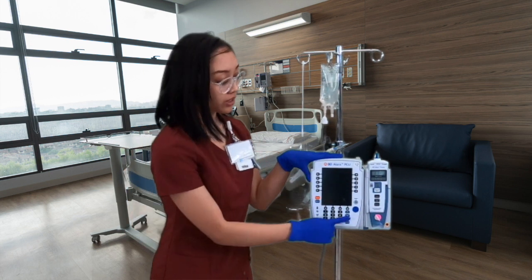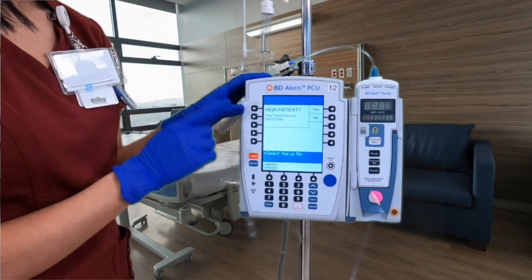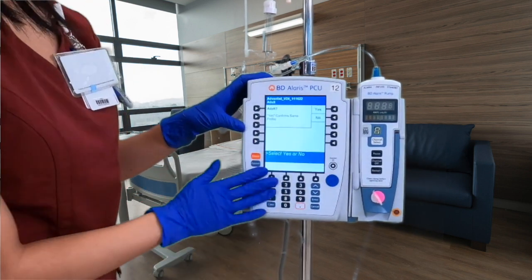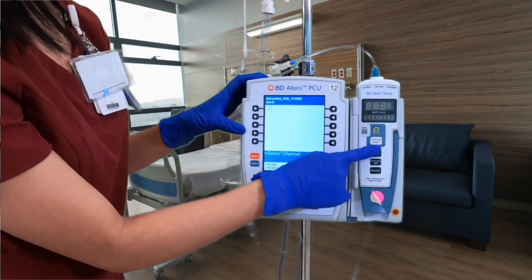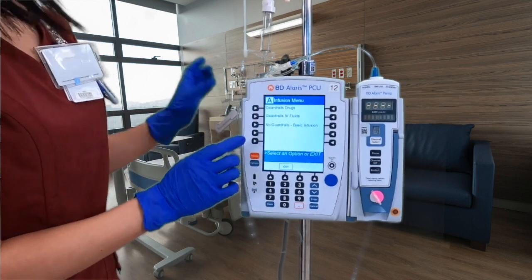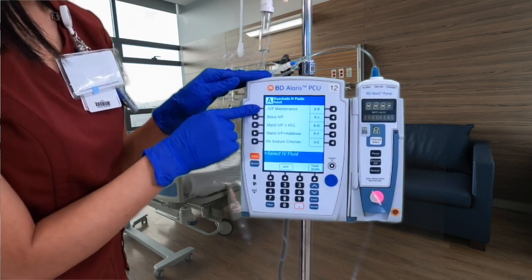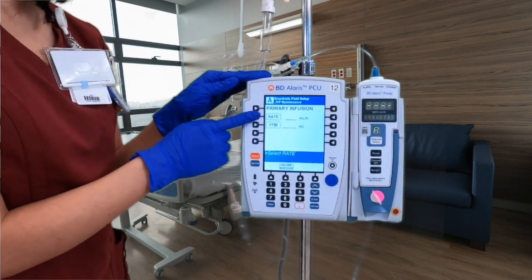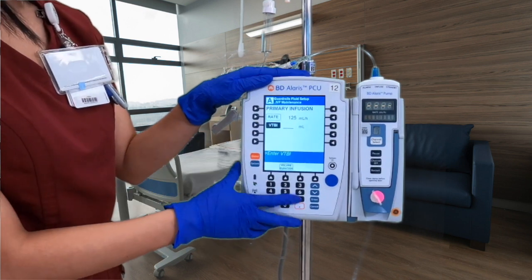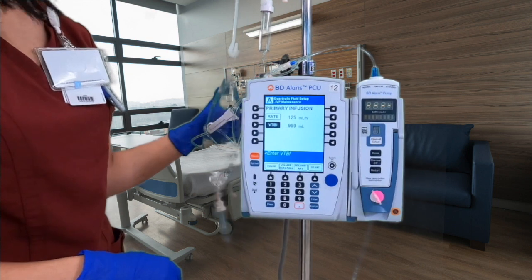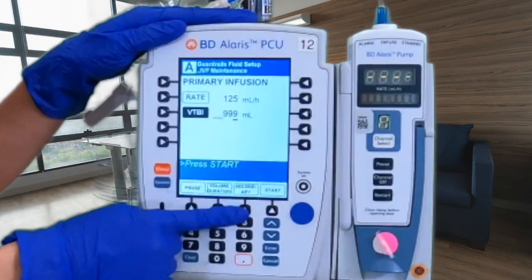Now we're ready to program. Press the system on button once. Because this is a new patient, press yes to clear previous patient data; because this is an adult, press yes again. Click channel select, then press Guardrails IV Fluids. Select IV maintenance fluid — yes. We now have our rate set to 125 mL/hr with a volume to be infused of 999. Check your order and your bags. We will not press start yet — instead, press secondary because we have a secondary fluid.